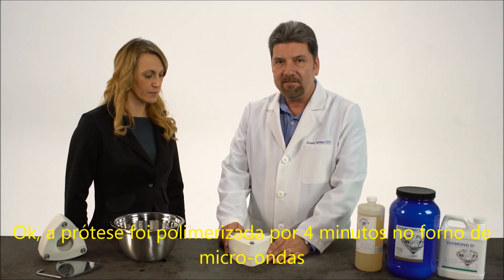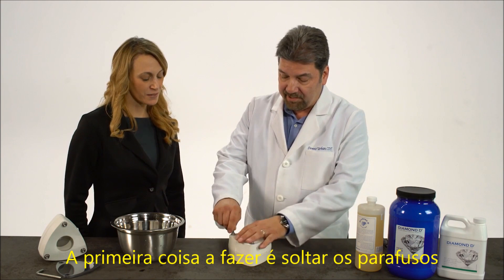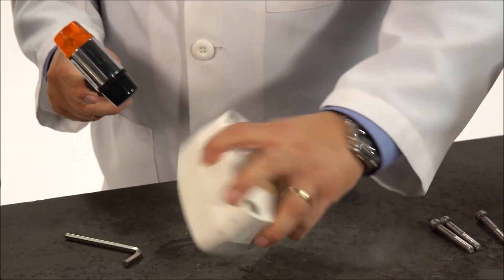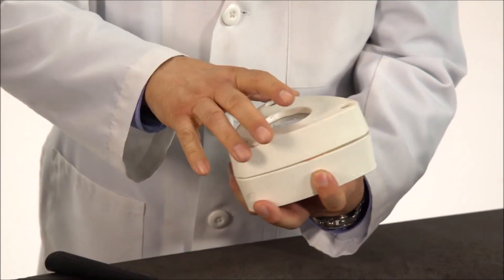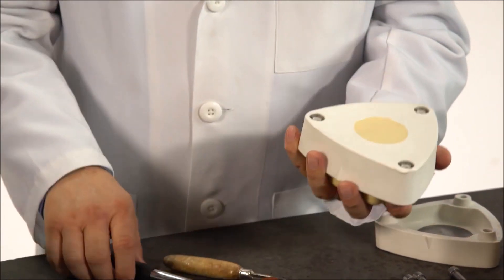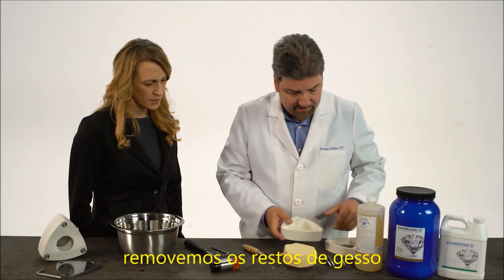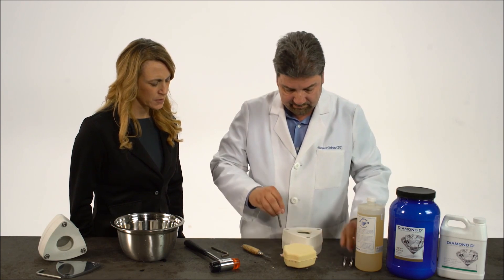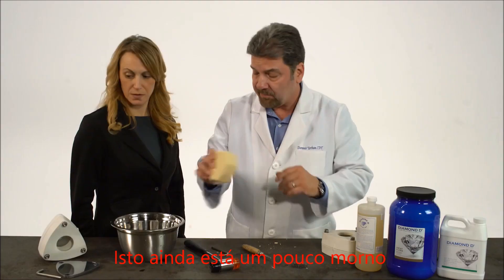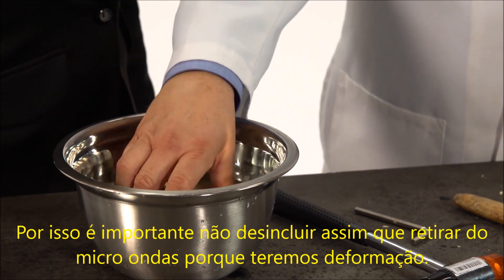The denture has been cured for four minutes in the microwave oven. We cooled it on the bench for 20 minutes, and we put it in cold water for another 10 minutes. So now we're ready to deflask the denture. First thing we do is loosen up the bolts, and then we grab our mallet. We hit on the plate — there's one half, there's the metal plate. Put it back in, then we hit it on the gypsum. Put away the pieces of plaster and stone, and your flask is ready for the next denture. This is still a little warm, so we want to cool it down for a second. That's why it's important not to deflask these right after it comes out of the microwave, because you'll get warpage.